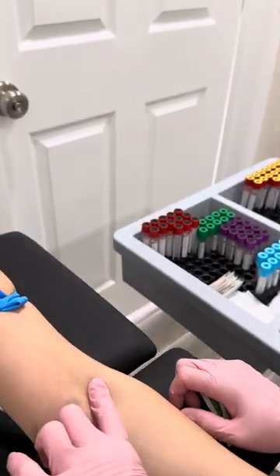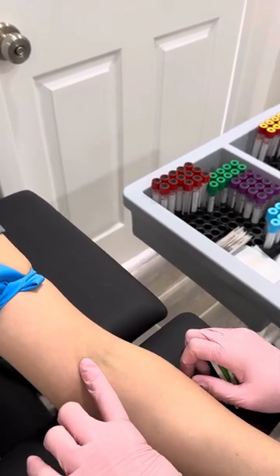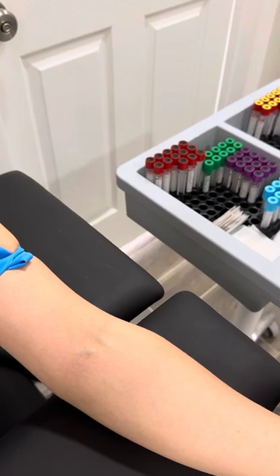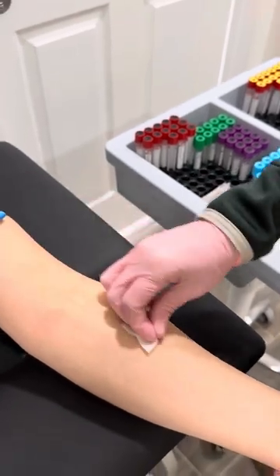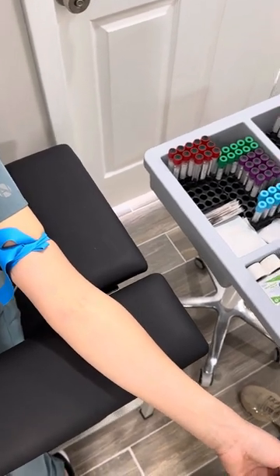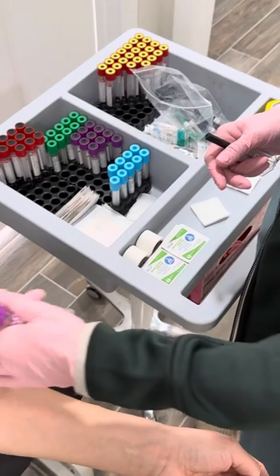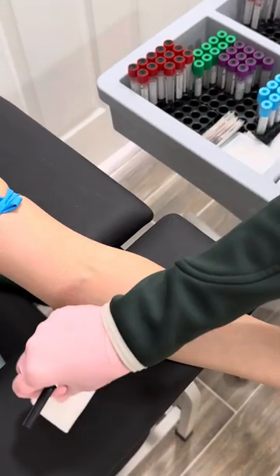Just feel your veins. Start at the bottom and feel the direction that they're going in and which one feels best to you to use. You usually want to go in at the bottom of the vein because if you don't, it'll roll on you. Clean it really good, go back and forth.